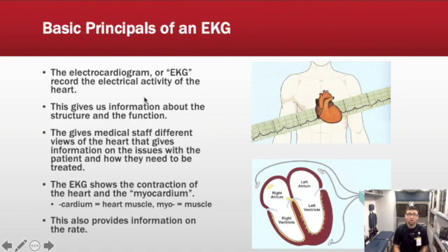The electrocardiogram, or EKG, records the electrical activity of the heart, and it gives us information about the structure and function. We want to know how this electricity is moving through the heart. This gives medical staff like us different views of the heart that give information on the issues with the patient and how they need to be treated.